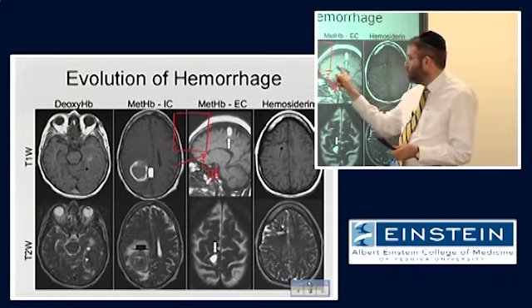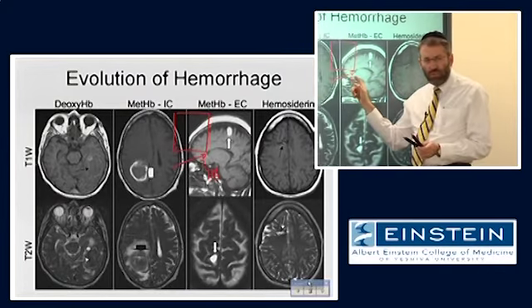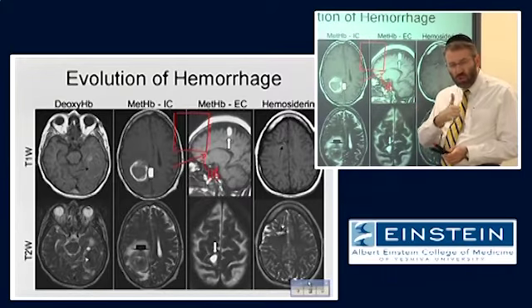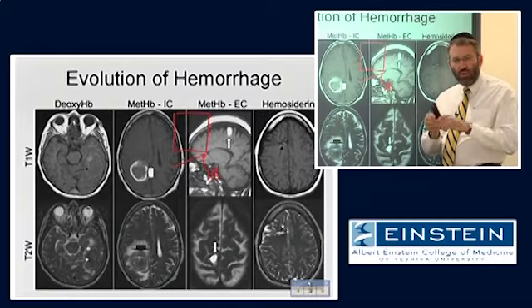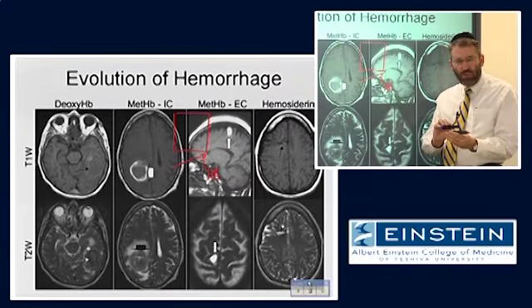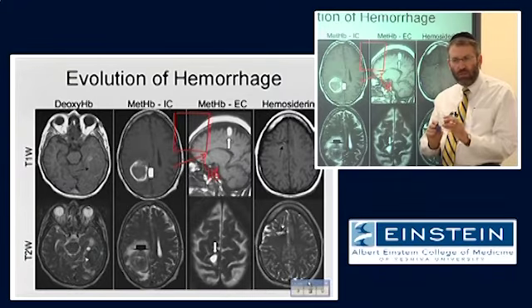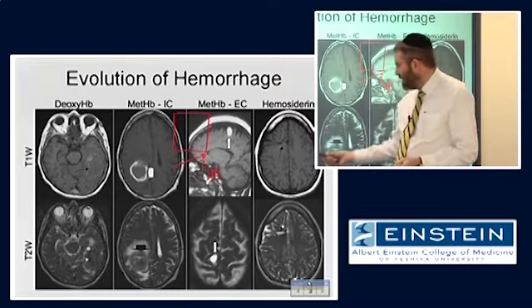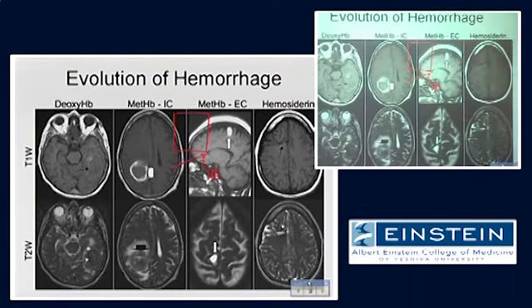If there is diffusion of these spins through the tissue, such that they change their location during that period of time, then although they might have dephased this much initially, if after the 180-degree pulse they're in a different location, they will not rephase completely because they don't have the same difference in precessional frequency. So even a spin echo image should show us this effect.